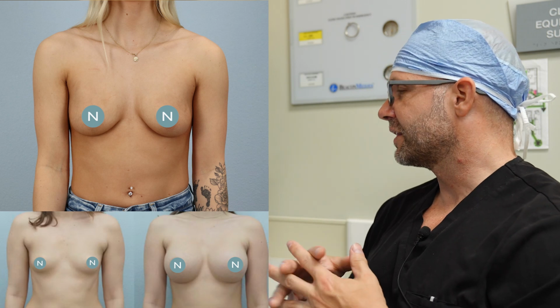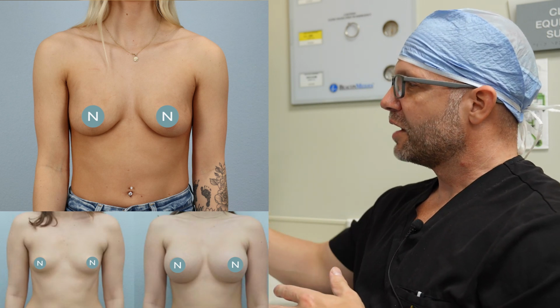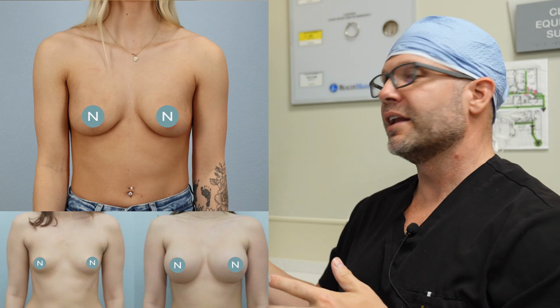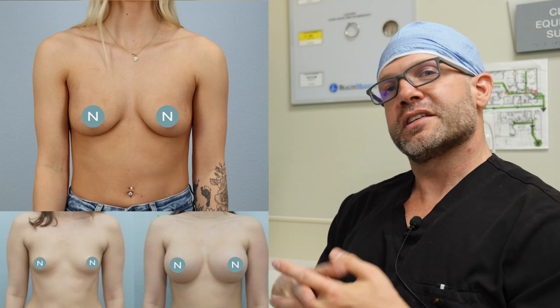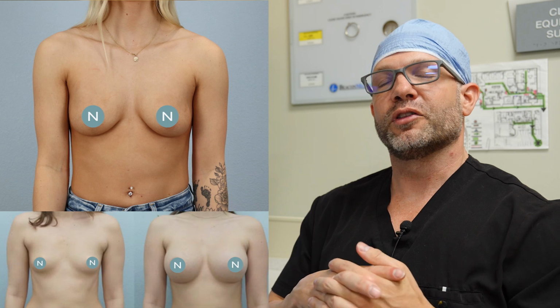So for a patient like this, who has this before and has this after of what she wants, I'm going to recommend for her that we're in the 400 cc range somewhere. And in the end, what I ended up doing is 415 and 450 on one side. So that's how we choose the breast implant size. It's really all based on the desire of what the patient wants.